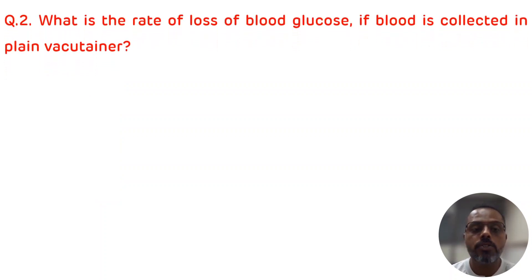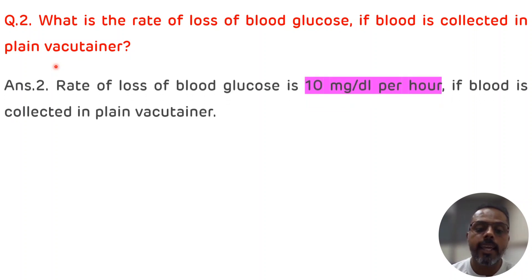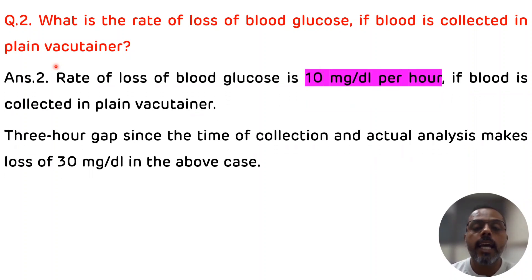Second question is: what is the rate of loss of blood glucose if blood is collected in plain vacutainer? The rate of loss of blood glucose if blood is collected in plain vacutainer is 10 milligram per deciliter per hour. In this case, 3 hour gap is there since the time of collection and actual analysis, so it will result in a loss of 30 milligram per deciliter.